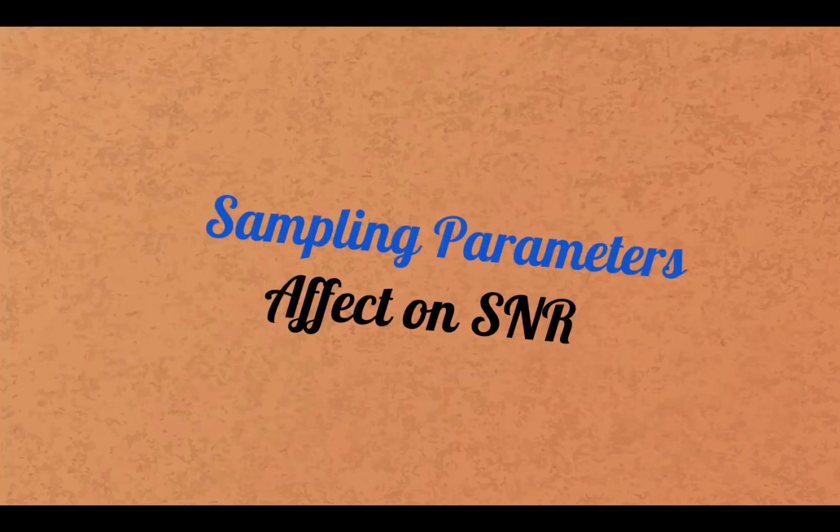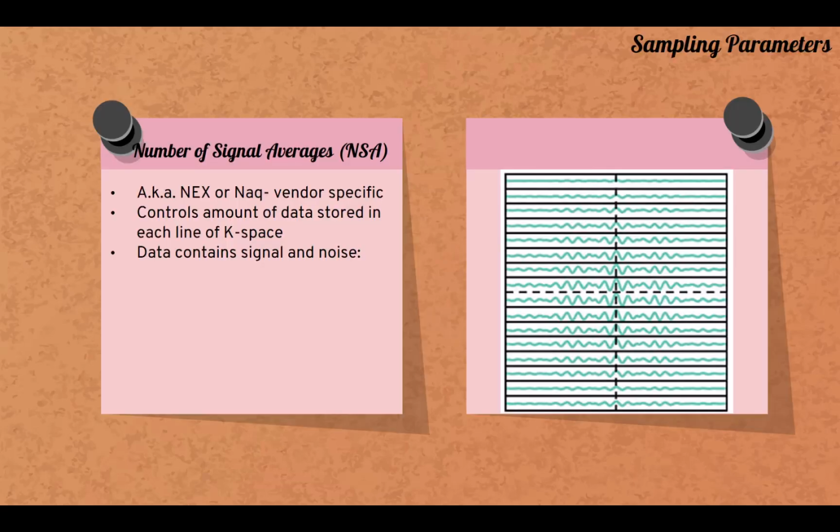Now let's discuss sampling parameters and how they affect SNR. Number of signal averages, NSA, aka number of excitations or number of acquisitions. This is vendor specific. NSA controls the amount of data stored in each line of K-space. Or you can think about it as how many times you go back and refill K-space. Data contains signal and noise.